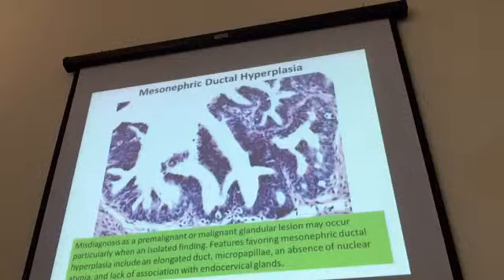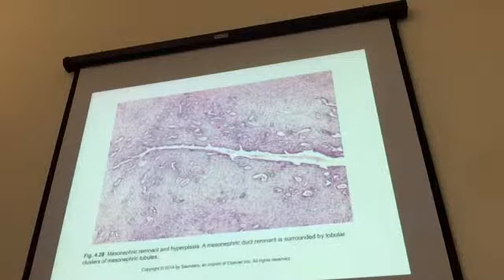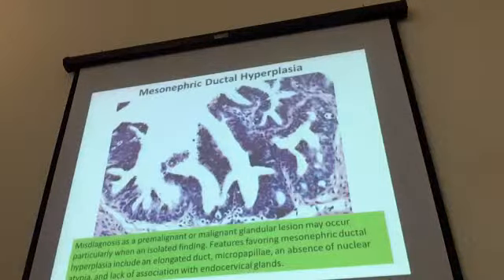On occasion, the ductal elements can become quite hyperplastic and quite atypical. So here we see, this is in a deep location, similar to this type of situation. But as you see, not just low cuboidal cells, these are more columnar. There's some cribriforming architecture. So this looks a little more concerning for cancer. And so therefore we can become very concerned about the possibility, and misdiagnosis is a real possibility.